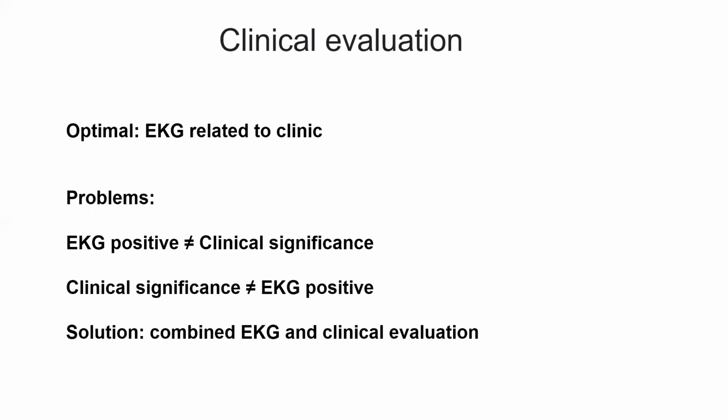So that's it. The key point of this discussion is that I want you to know how to approach the EKG step by step, how to read the EKG using about 11 steps, so that you won't miss any details.